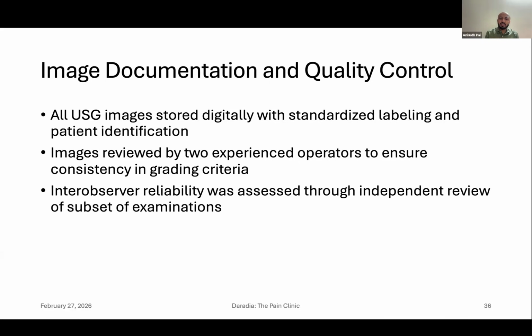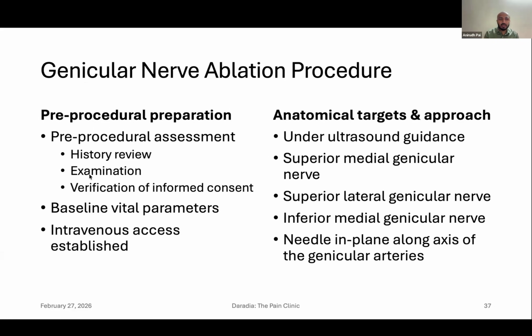All the USG images that were noted were documented properly, and at least 2 people went through the images, and some images were even given to an independent person for independent review to make sure that there was reliability in the inter-observer assessment.